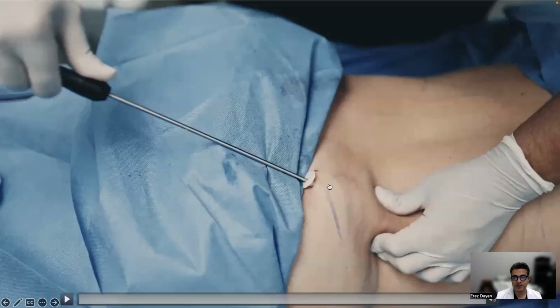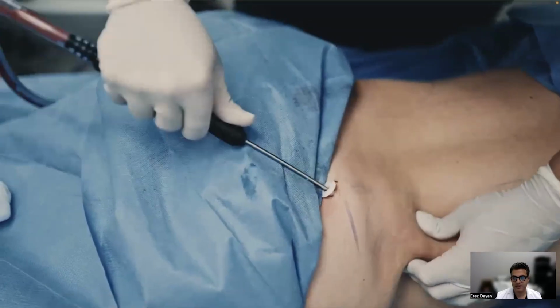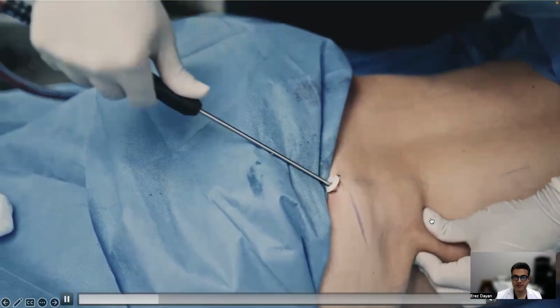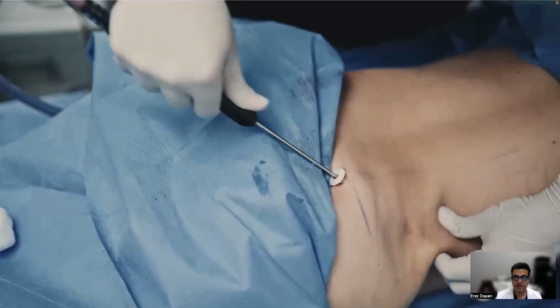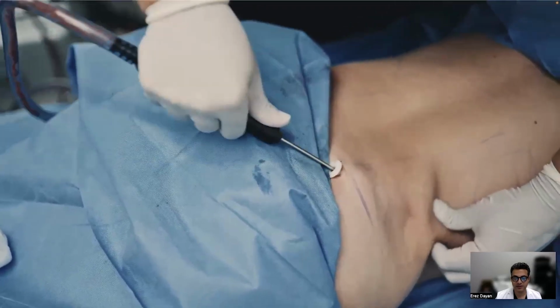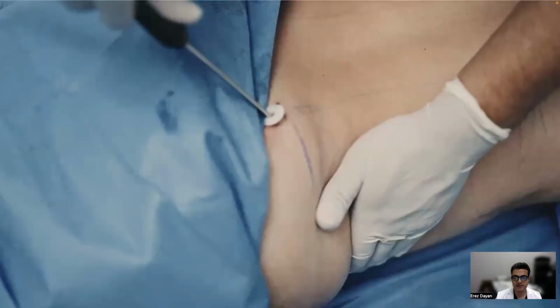Here's another example on the flank area. So here, the liposuction cannula I'm using to empty out the flank. I'm feeling my skin pinch on the left hand, really getting a sense of how thick I am. Now in the flank, I really want to empty it out, so I'm being a little more aggressive by going more superficially. And I'm feeling exactly how thick my skin envelope is.